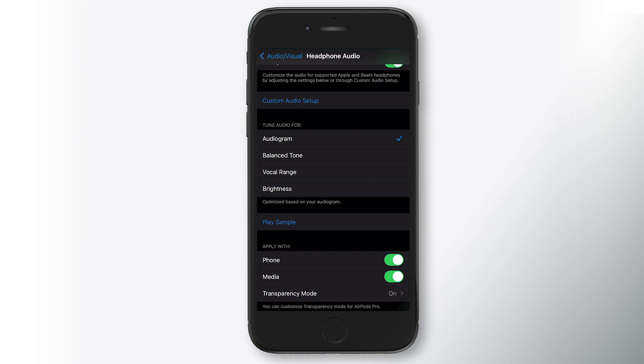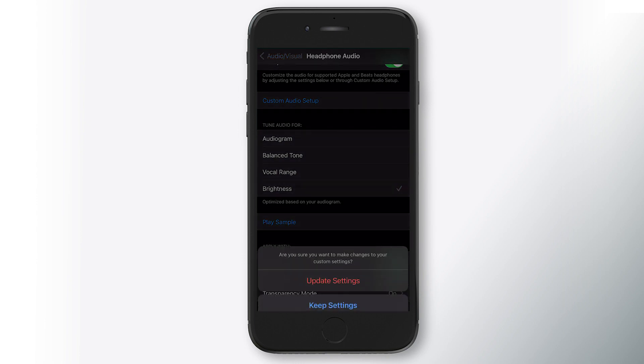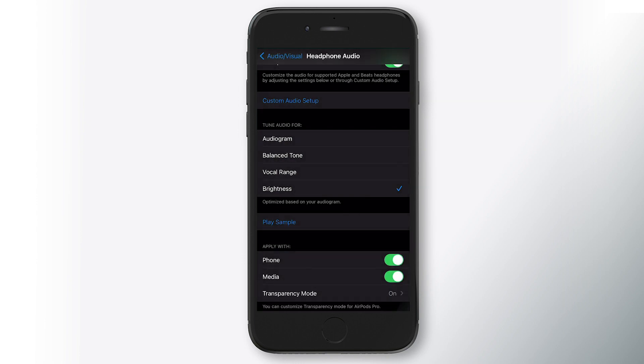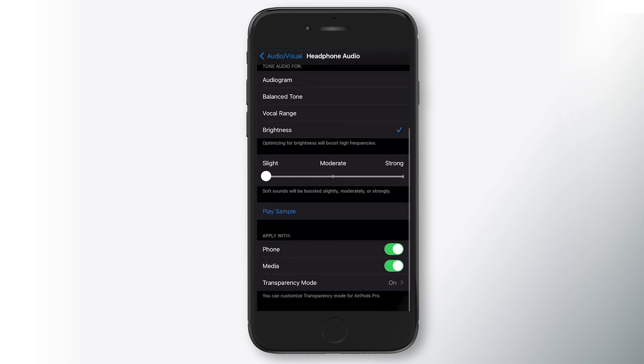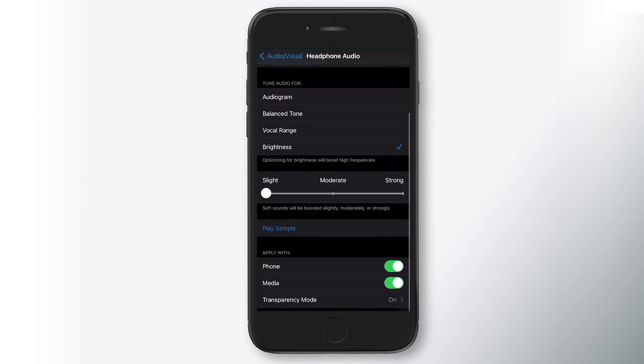I wanted to hit one final thing, and this is confusing for some folks, especially if you don't have an iPhone, you only have an iPad and you still want to boost your custom transparency. You can. You don't have the option to use your audiogram on iPad OS. You can still come in here and say, I want to boost brightness. So this is like generic bright tones. So you'll see here that you have now a slider that says slight, moderate or strong, and you have custom transparency at the bottom.